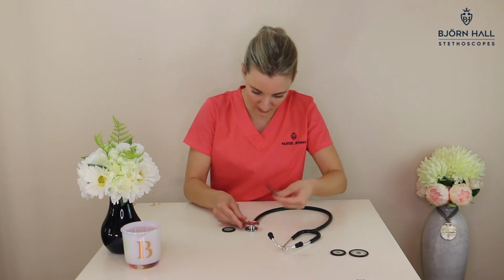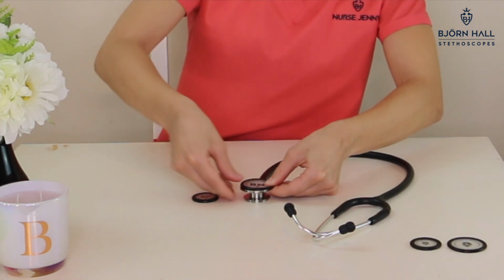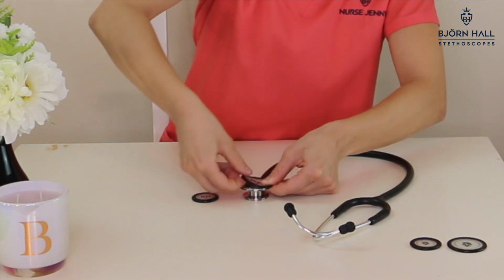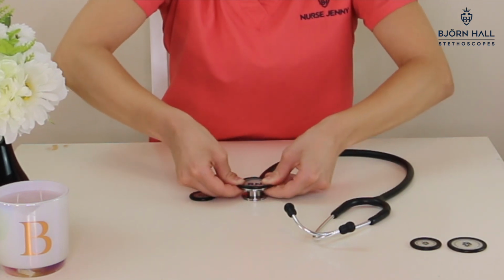So getting the diaphragm on, what you're going to do is push in on one side, get the ledge in there, push in on the other side until it is in the groove. Just like that, and then push down on both sides. You've got them in on both sides.